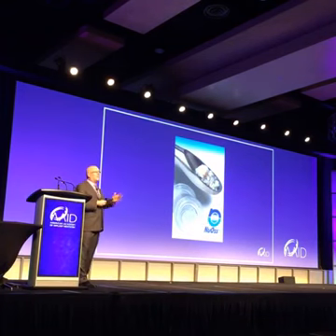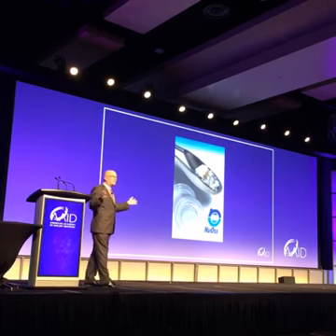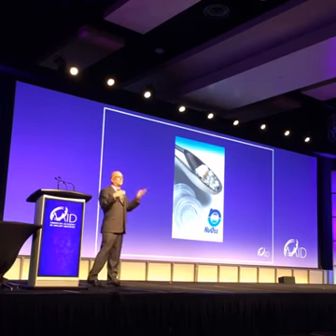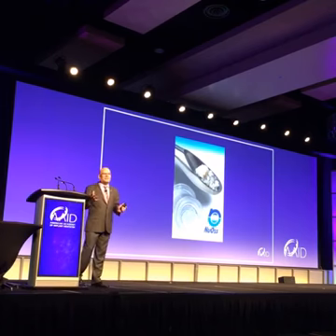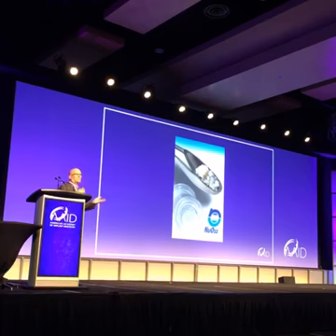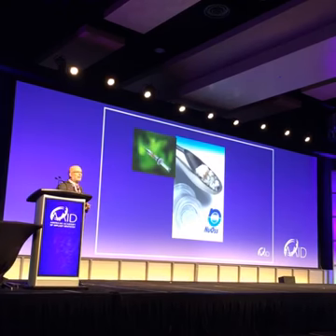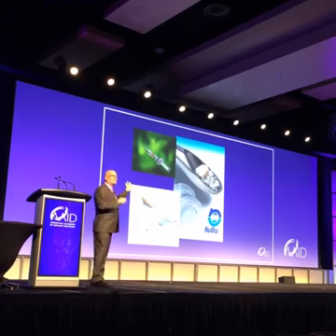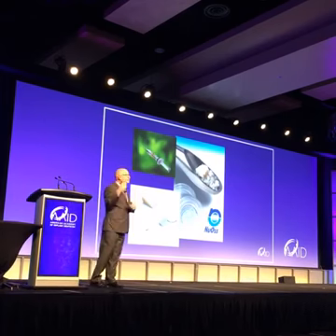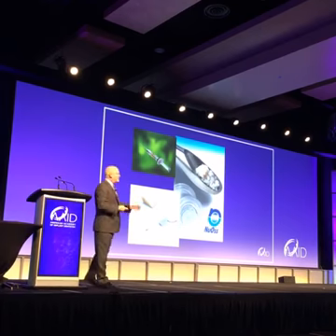So now that I've used all of these things, I'm not endorsing anything. I just need to pull some pictures off the web to show different things. So when you're treating periimplantitis, you have a lot of decisions to make. You decide, am I going to use cow bone? Am I going to use horse bone? There's Equimatrix. There's a bunch of them. Am I going to use like a xenograft? Am I going to use a biomimetic? Am I going to use grandma? Dead people powder, bone. People have to work with me here. I can't do this alone.